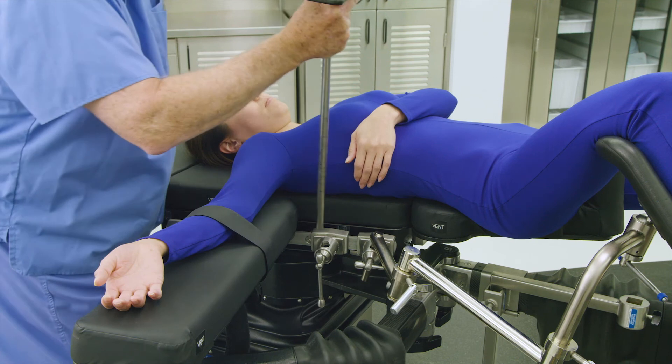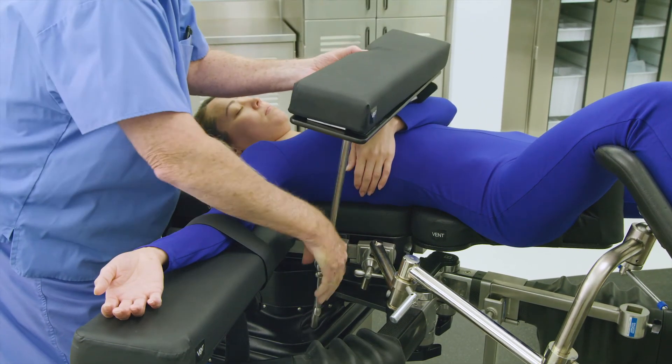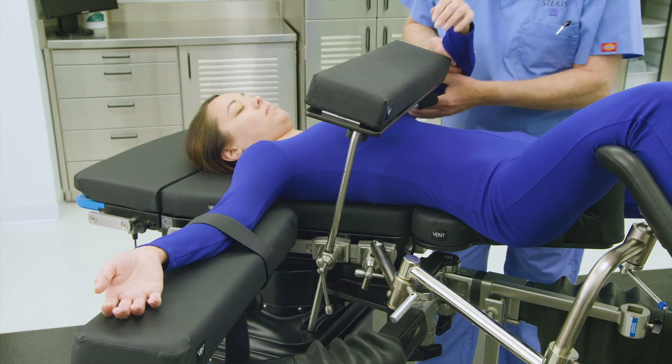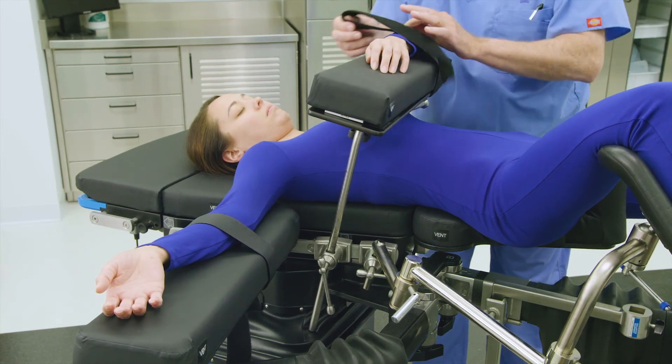Next, mount the multi-position arm board into the socket clamp, adjust the height and position of the arm board above the patient's torso, and tighten the socket clamp to secure. Place the patient's operative side arm into the multi-position arm board and apply the safety strap to secure the arm.